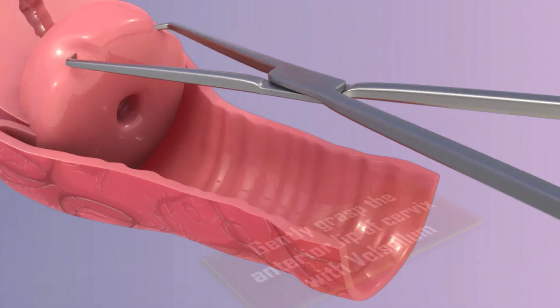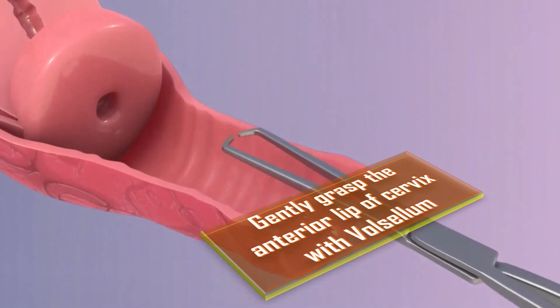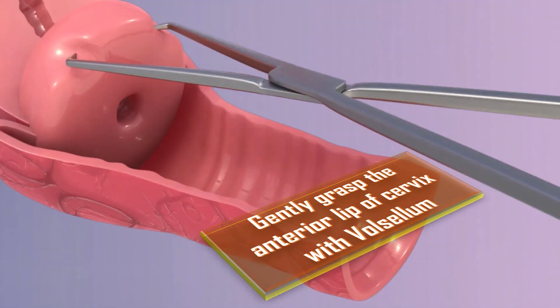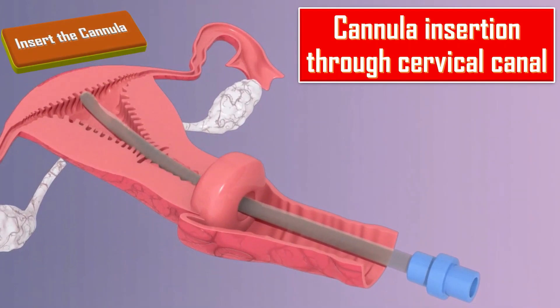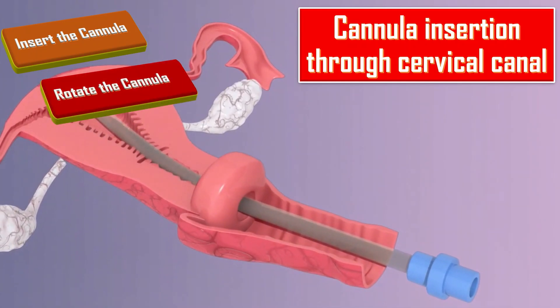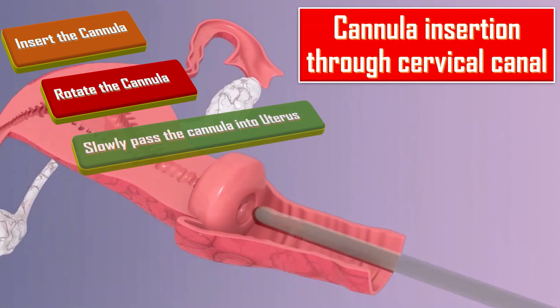I will gently grasp the anterior lip of the cervix with vulsellum or single-tooth tenaculum. Dilation is needed only in missed abortion or when products of conception have remained in the uterus for several days. While gently applying traction to the cervix, I will insert the cannula through the cervix into the uterine cavity, rotating the cannula while gently applying pressure to help the tip pass through the cervical canal. I will slowly pass the cannula into the uterus until it touches the fundus but not more than 10cm, measuring the depth by dots visible on the cannula, then withdraw the cannula slightly.